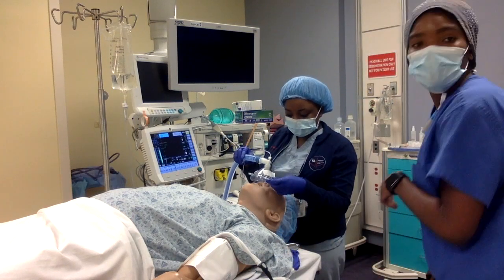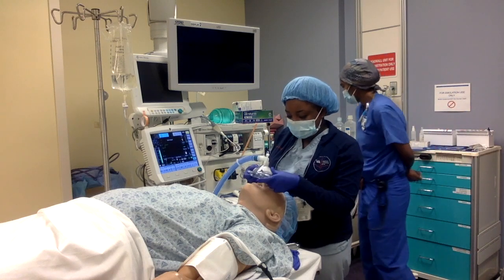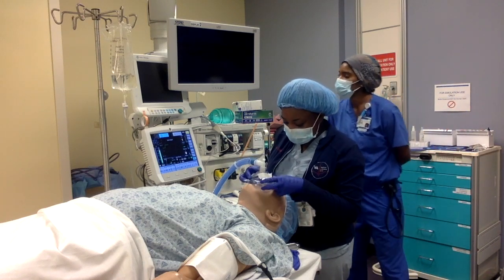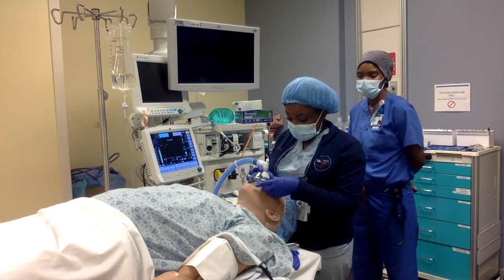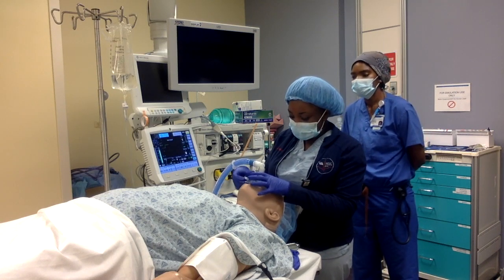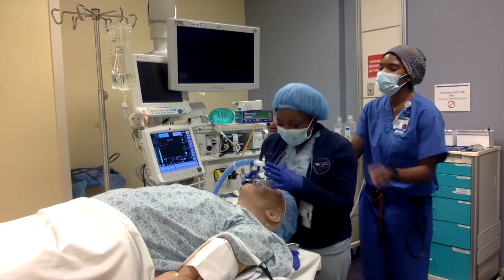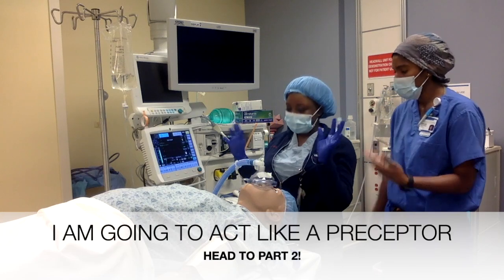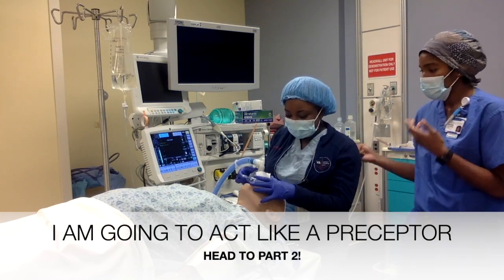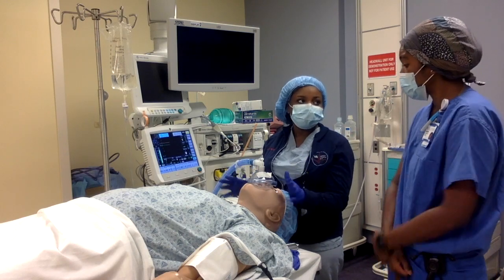Now I'm putting this mask on her face. The reason I'm doing this is we're trying to denitrogenate and increase our FRC. At this point everything has to get precepted, especially early on in the early stages.